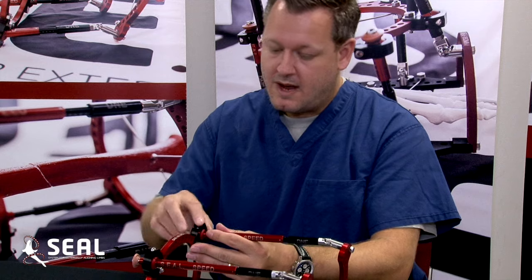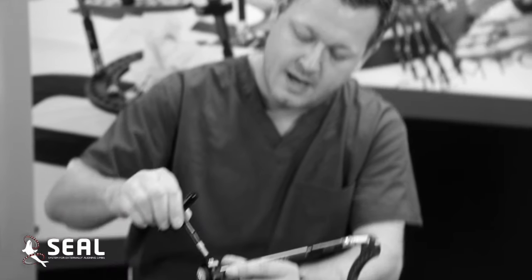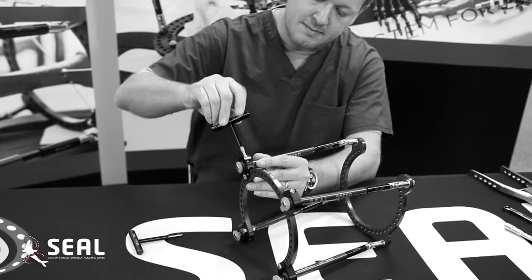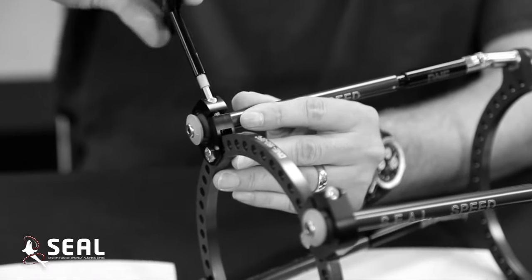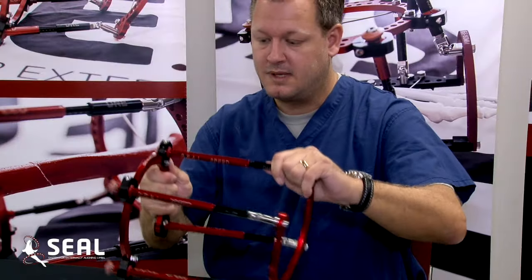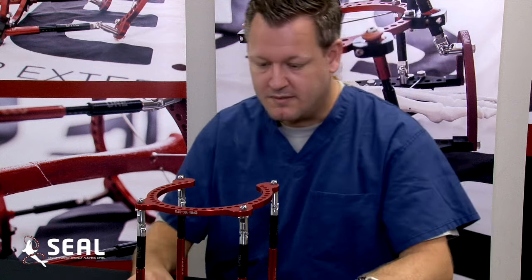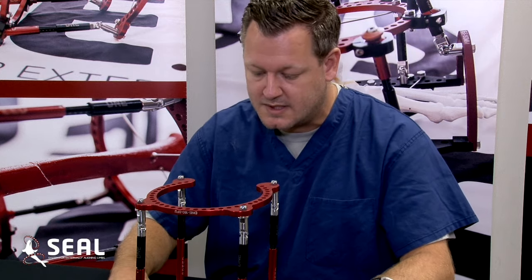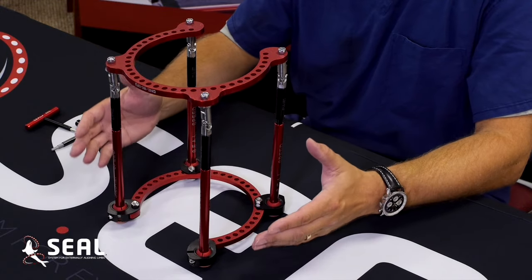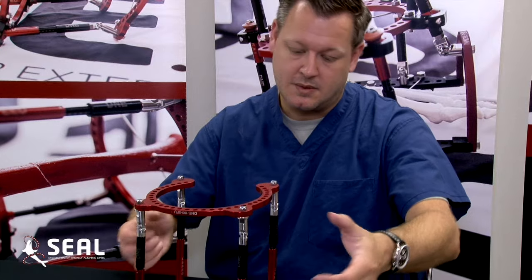Aside from that, you have your inferior clamps, which again are color-coded, with your nice black wrenches. They simply fit into the bolts, and you can completely, with a few turns of the hand, lock that completely down. So as you can see, the frame is completely versatile and very universal for a multitude of pathologies — fracture manipulation, static structural correction, expansion, distraction, as well as any angular fixation for any type of deformity.